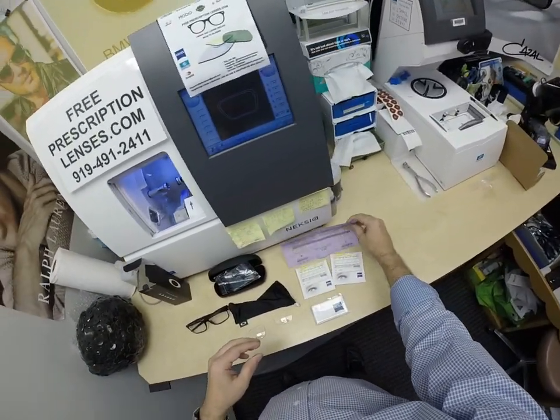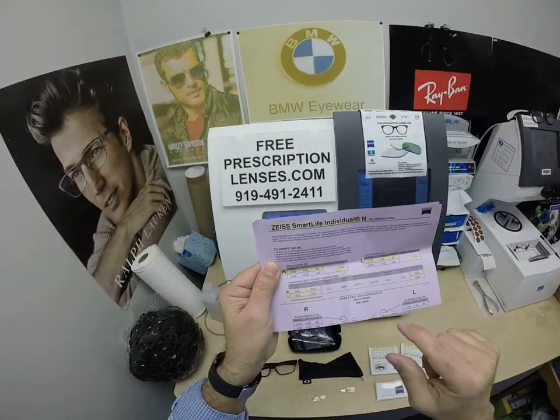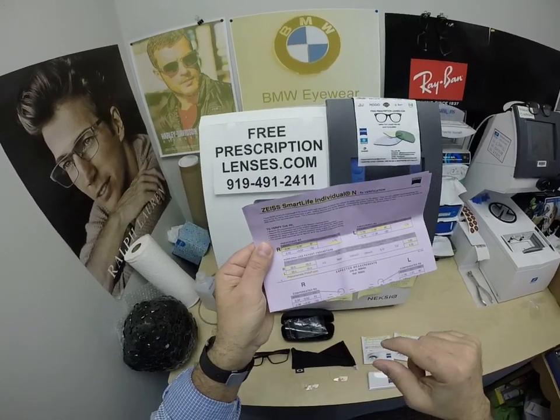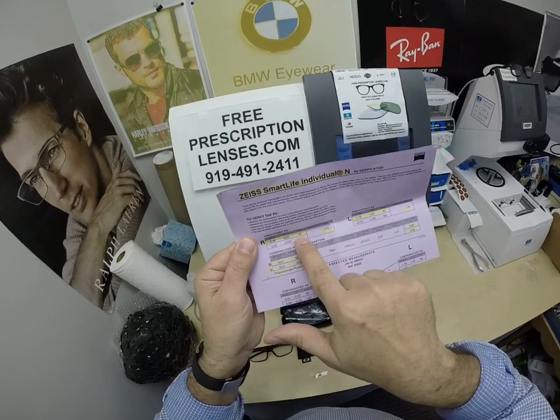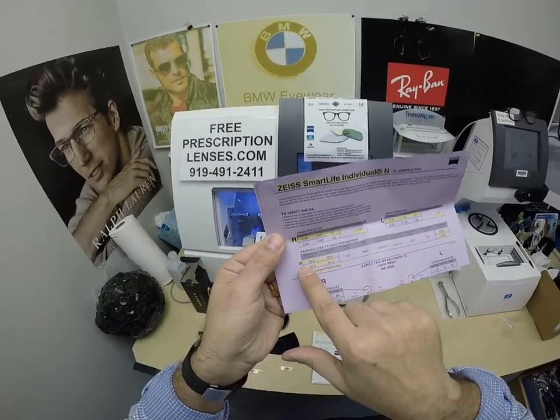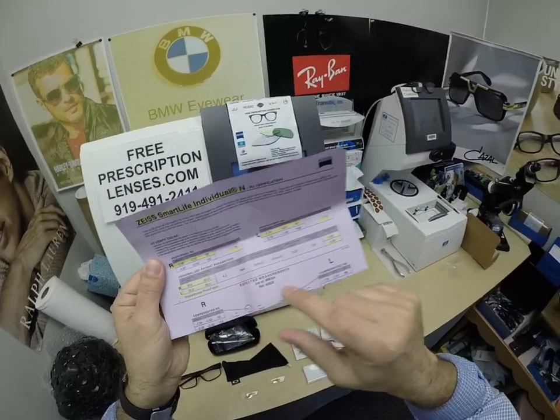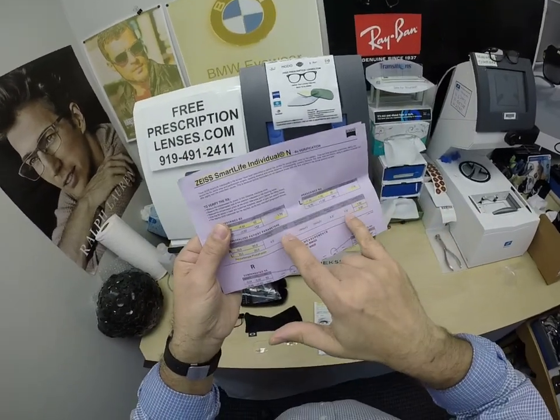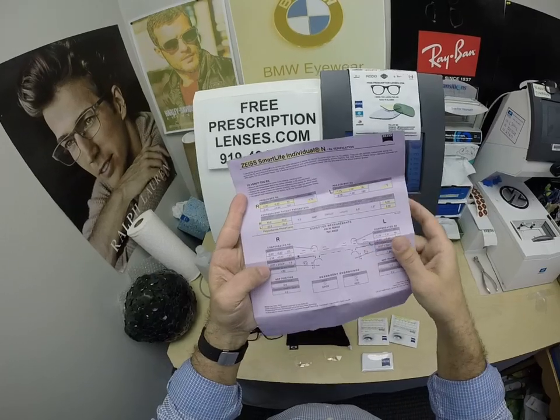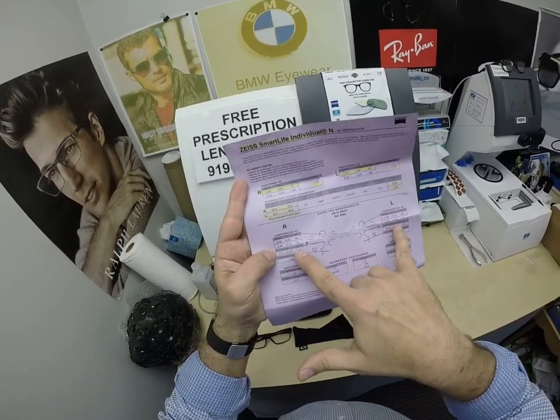He upgraded to the top-of-the-line Zeiss progressive lens, the Smart Life Individual. It is polycarbonate with the Photofusion Gray and the DuraVision Platinum anti-glare. I've highlighted the prescription for the right eye, the add power, same for the left — the add power, pupillary distance, fitting height, optical center of 20 as requested, the five base curve, and some of the default settings for the individual lens. Because this is a digital free-form lens, Zeiss provides you with the compensated formulas for distance, intermediate, and near.